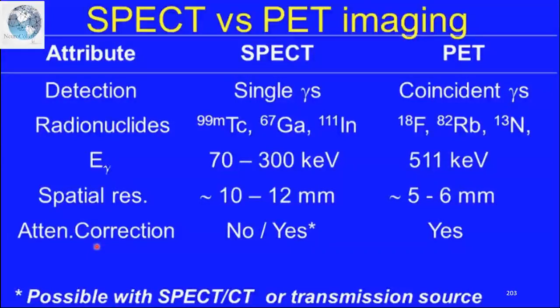Okay, so bandingkan SPECT-CT now with PET-CT. Okay, dua jenis modality yang berbeza, kita bandingkan sekali lagi. Macam jenama X dengan jenama Y. Okay, alright. So we're looking at two different modalities. The SPECT that is using a gamma camera as the basic unit, and the PET imaging.